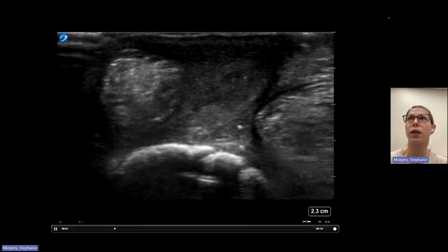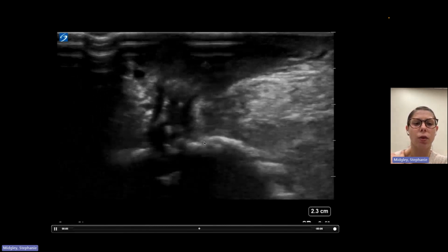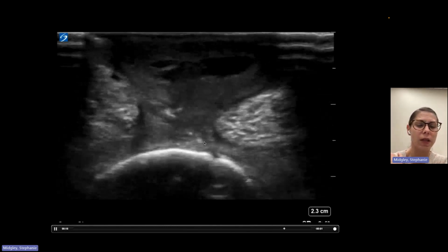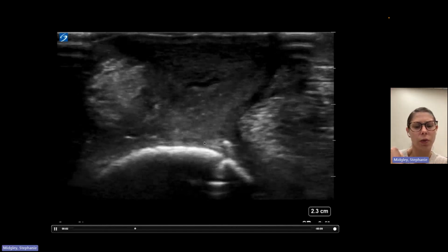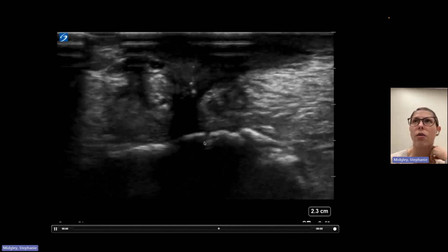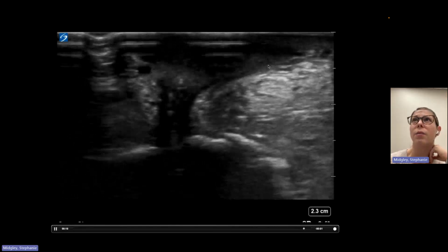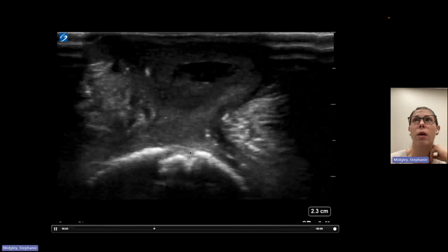This case was from our ER here. This was a gentleman who had had a shoulder replacement done a couple of years ago, who had come in with what looked like an abscess, not exactly on the suture line of where his surgery was, but next to it. We were just doing educational scanning rounds and had plopped the probe on, and this is what we saw. And you can see that abscess actually tracking all the way down to that bone.